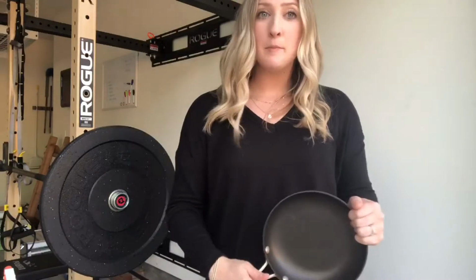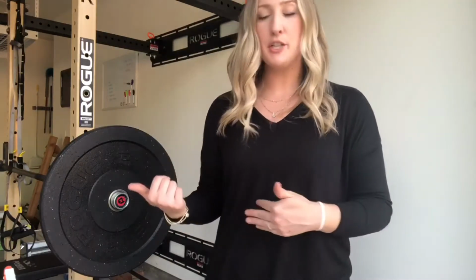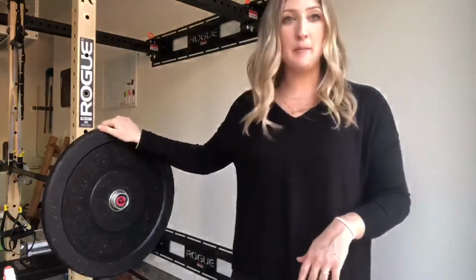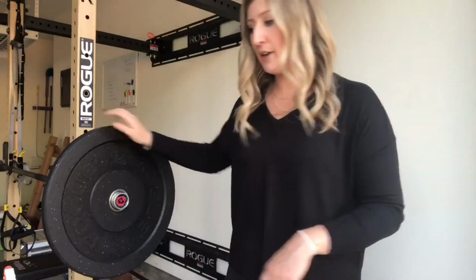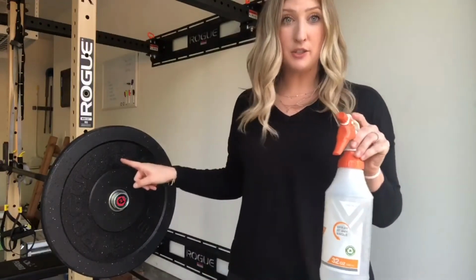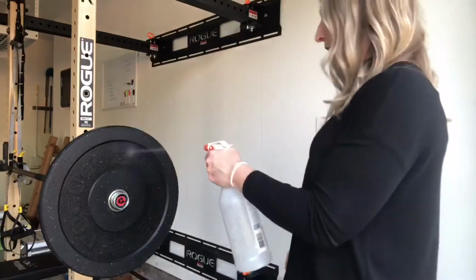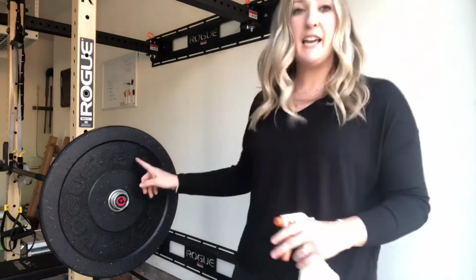Now, heat is the biggest threat in our X-ray tube, so everything we do in our design of the X-ray tube is going to be to prevent excessive heat buildup, which is why we have what's called a rotating anode or a moving target. I'm gonna show you what I mean by this with a quick demonstration. So this right here is gonna be our target or our rotating anode. The water coming out of the bottle is going to be the incoming electrons hitting the target.